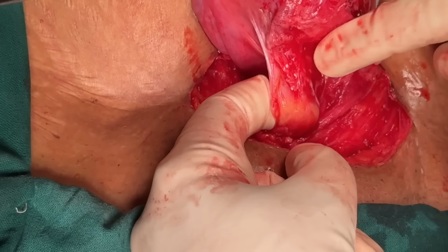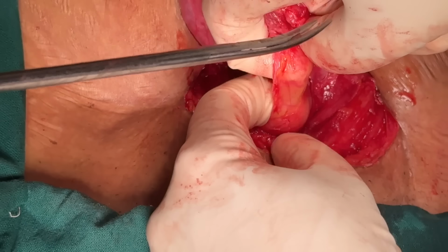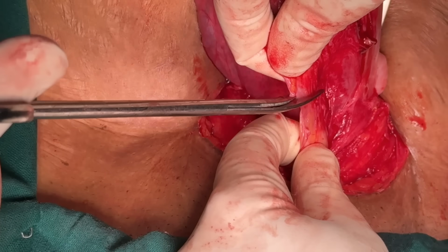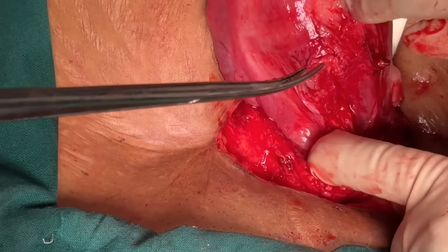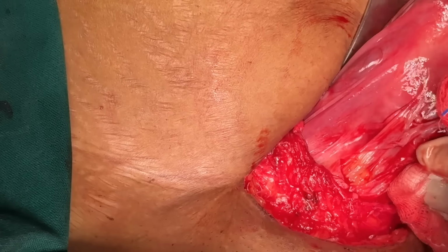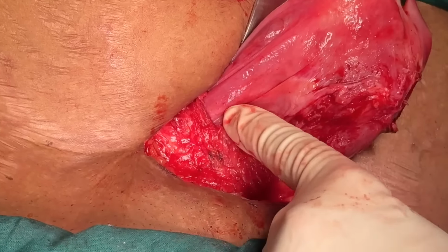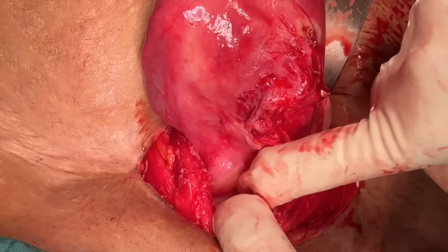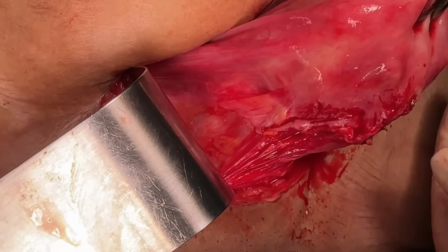Now, can you see this yellow fat here? Whenever this yellow fat comes, you must realize that the viscus is nearby. All pelvic viscera are wrapped with a visceral fat layer. So whenever you feel that the yellow thing or the fat kind of thing is coming in your way, move away from that field and don't go near that. That means you are near the bladder.